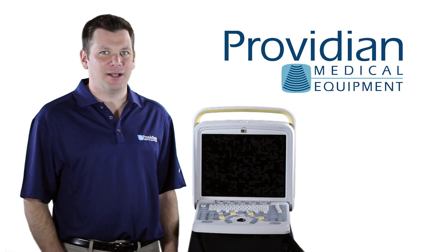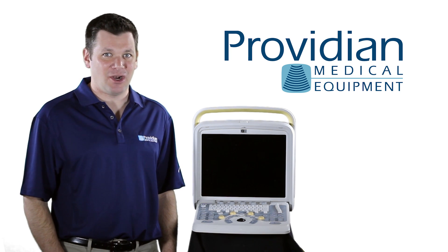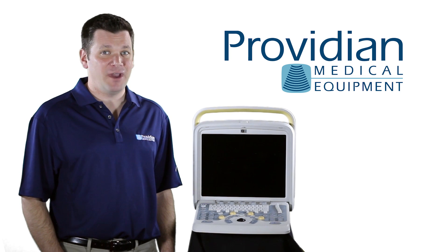It has complete measurement analysis packages and presets for OB, GYN, abdominal, vascular, small parts, urology, and basic cardiology. It can also be configured for veterinarians with a very good vet package.